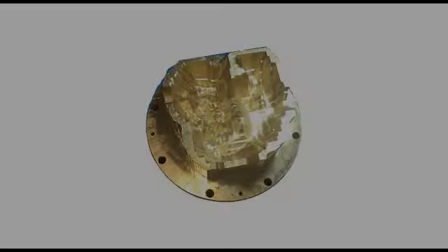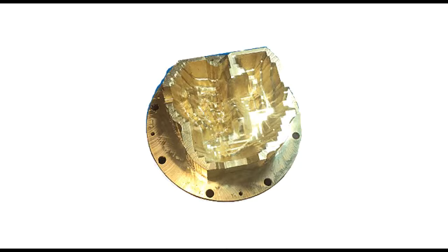Compensators are basically pieces of metal that you put into the beam to attenuate dose where you want to attenuate it. Here's one from a commercial vendor. Let's look at how these work.